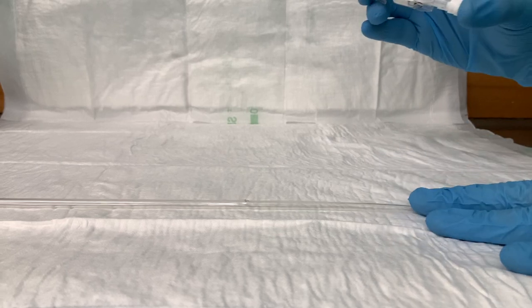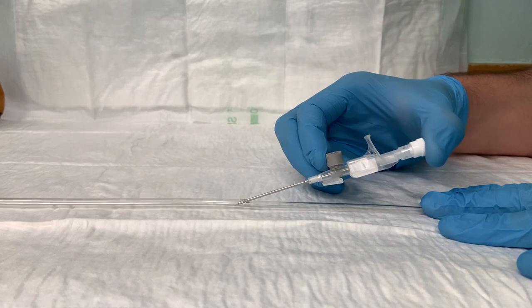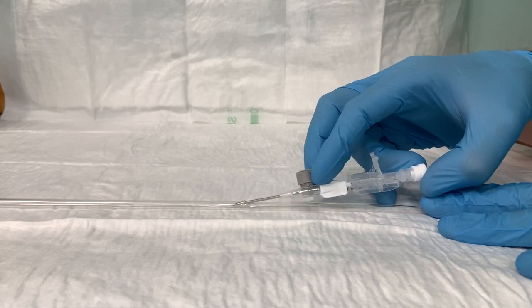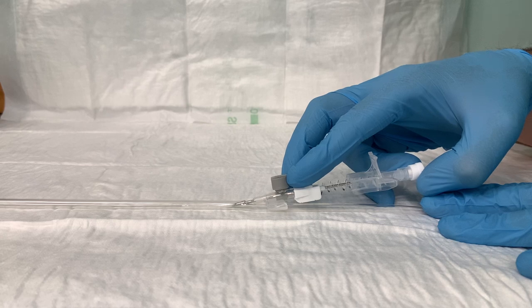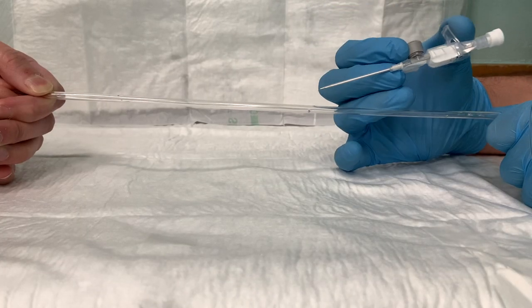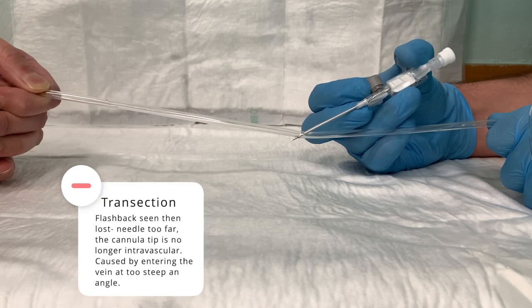The other approach is to get into the vein, ensure both catheter and needle are in, then hold the needle steady with the thumb and fourth finger while pushing the plastic cannula forward. A common problem is vein transection, where you pop the Venflon out the other side of the vein — you get initial flashback but then blood stops flowing when you try to thread the cannula.